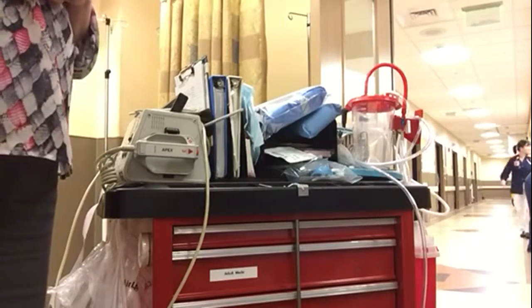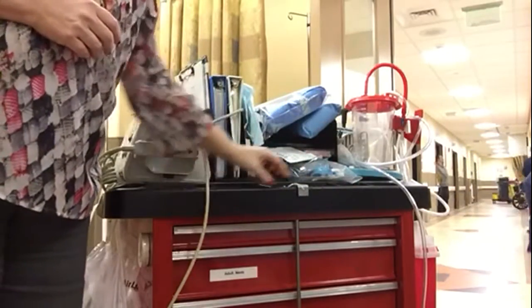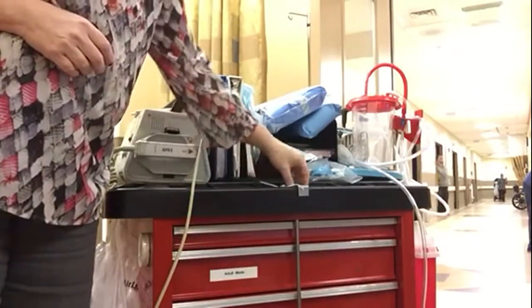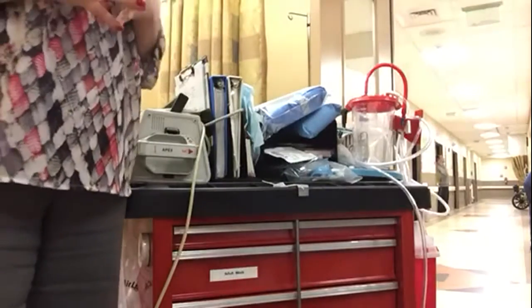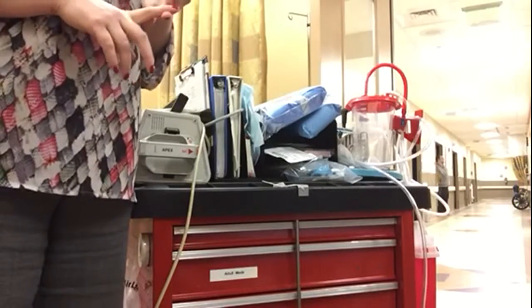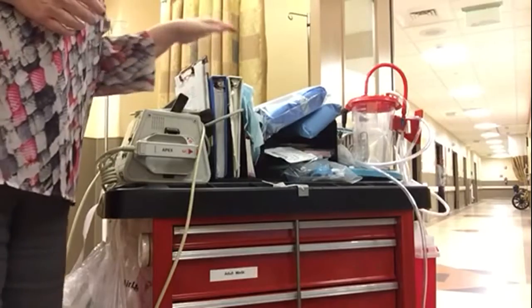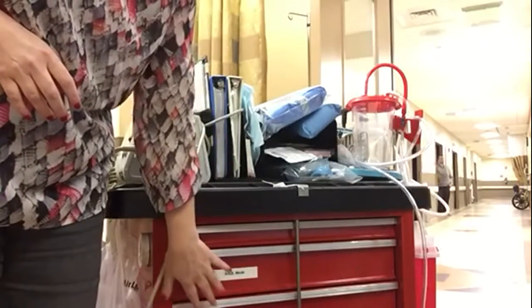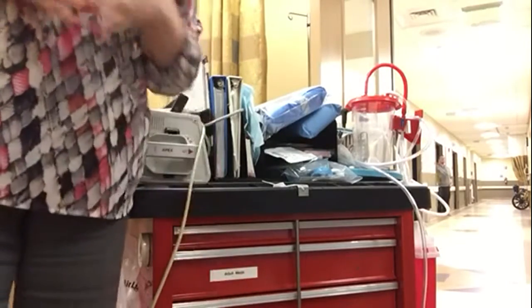Let's talk about crash carts. This is a crash cart in an emergency department. Here's the lock that keeps all the drawers locked; when we open it, the black comes up and the drawers open. We keep it locked so all equipment stays in place — someone is accountable for locking it and making sure medication and equipment outdates are taken care of. The drawers are labeled: adult meds, intubation equipment, IVs, and fluids. There are also some pediatric supplies.